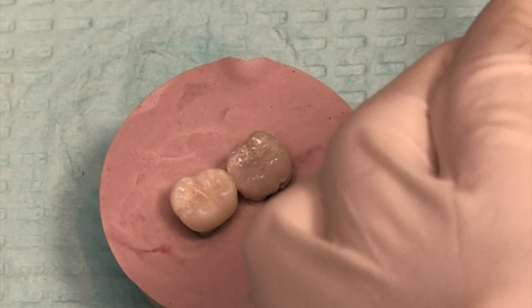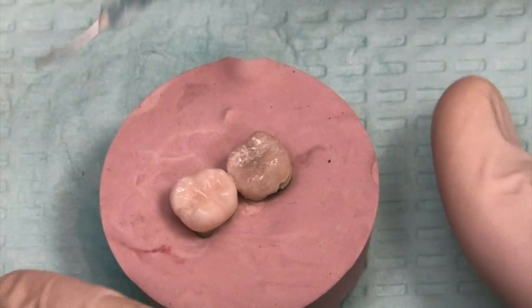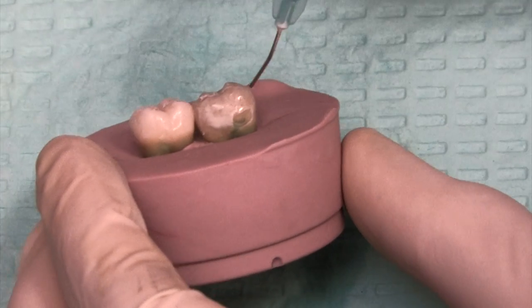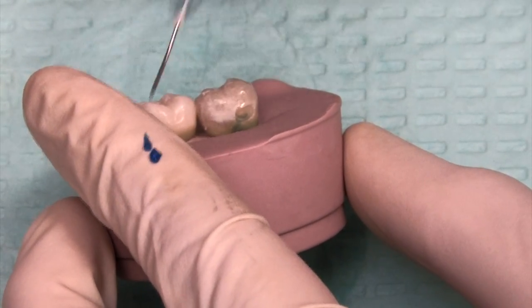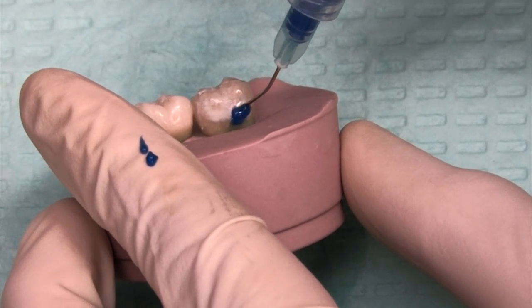Sometimes you can put a retentive groove up underneath the occlusal part of the prep. You can go in with a small round bur and create more of a macro mechanical lock. But I find most of the time, as long as you have a good enamel surface, you should be able to be alright without it.